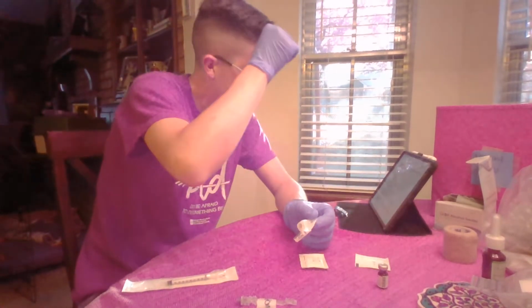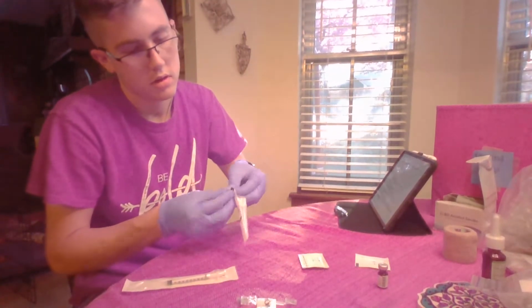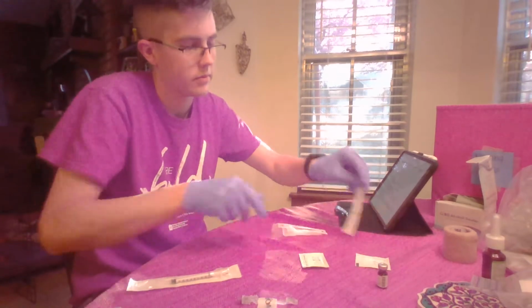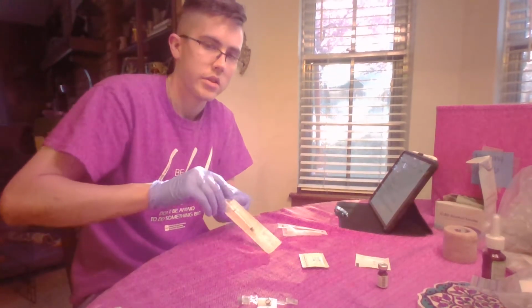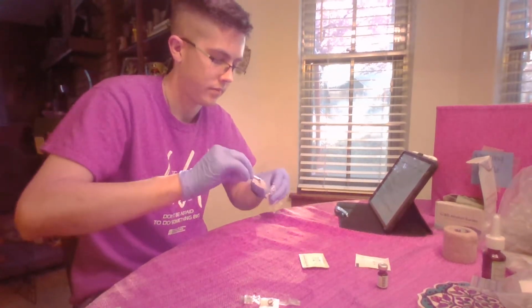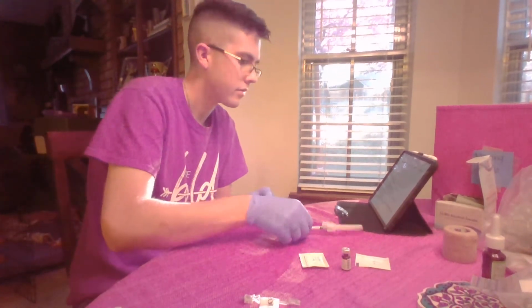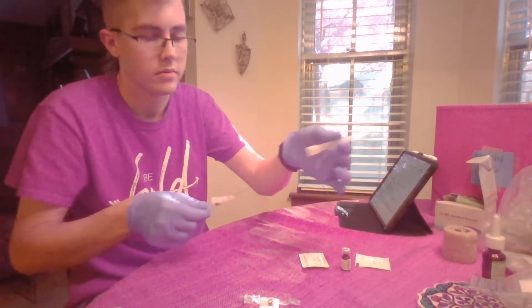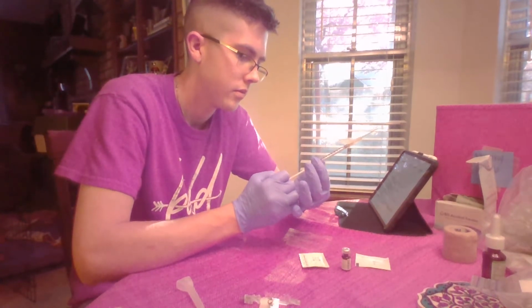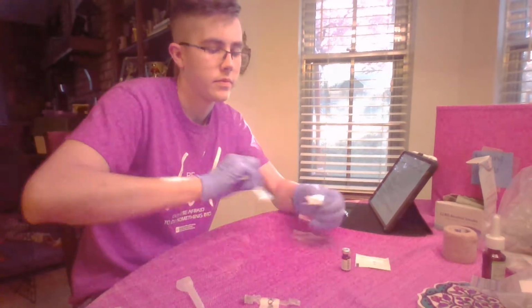Okay, did all that. Next, I need to assemble the syringe and needle while maintaining sterile. Okay, so I can go over, peel that back. This one. Peel it back. Okay. Set that aside. Undo the cap. Pull back 1 milliliter. There we go. Set that aside for right now.